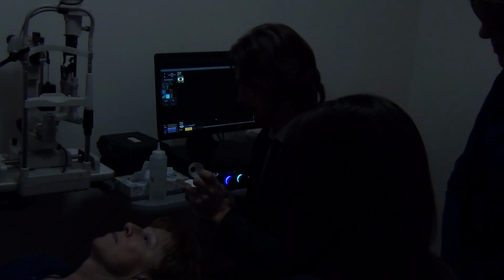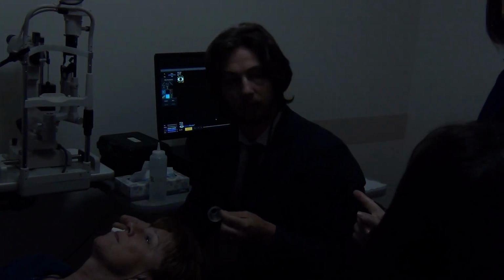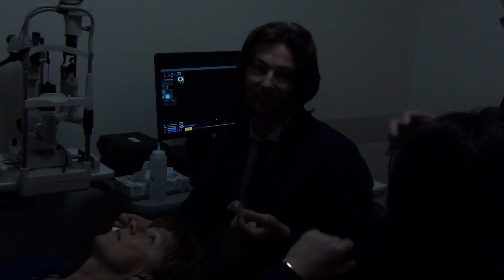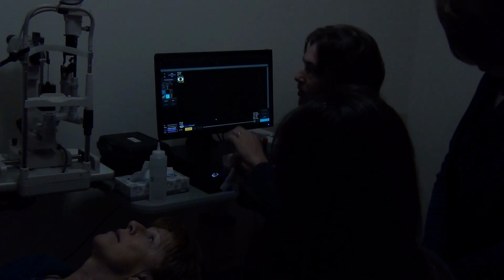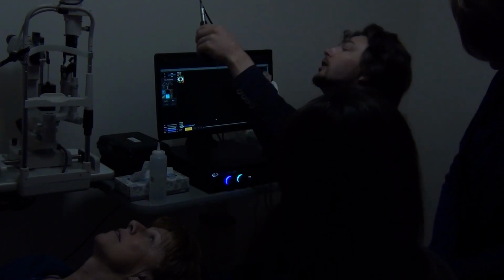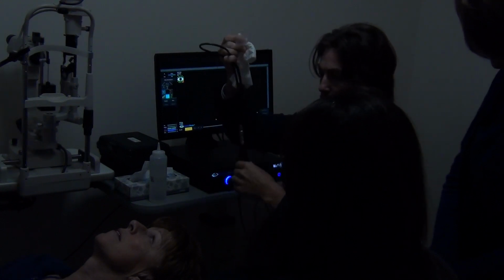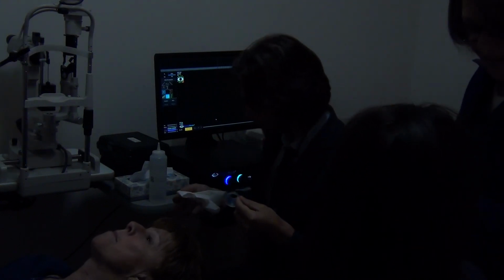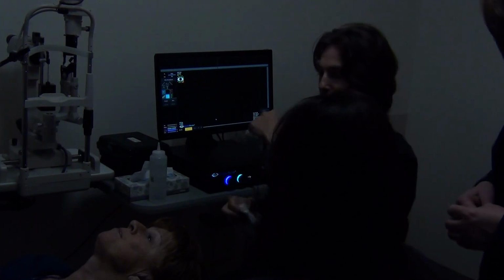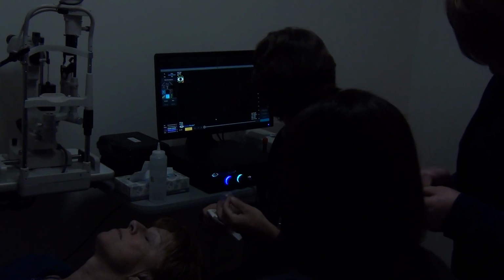I usually hold tissues and the probe. Too many things together. See, I didn't put the probe around my neck. That's why I needed more hands. This way is easier. Once you learn, you'll figure out the location. I see some doctors like to use an arm and have the entire cable like this, and then they just grab it and have a little bit of motion to go down, not too far. But the best way is to go around the neck. Especially if your unit is right there and you need to reach it and come back, it's just a nightmare. So let me just test that it's working right now.